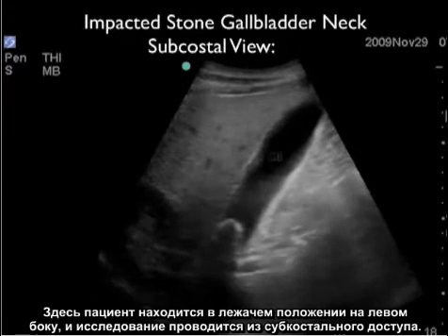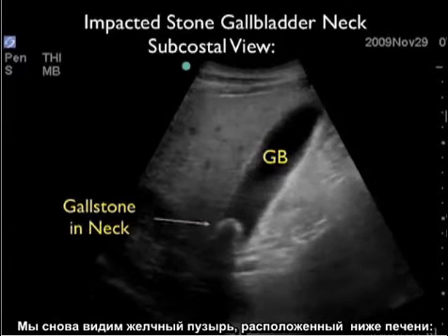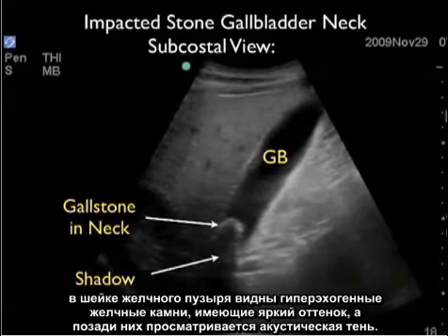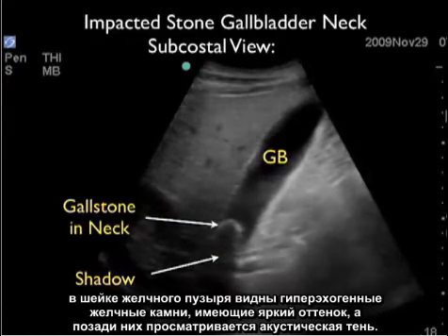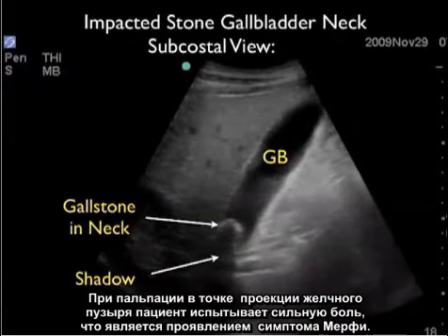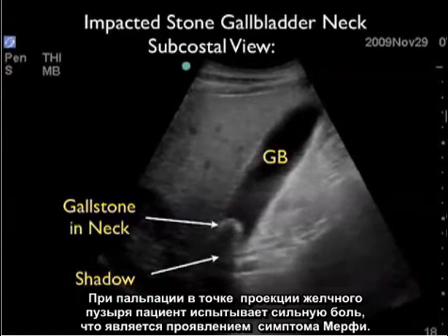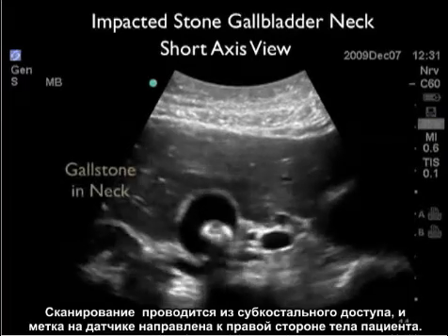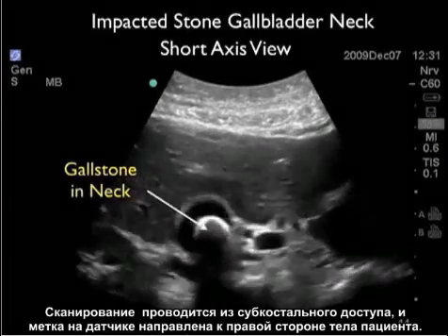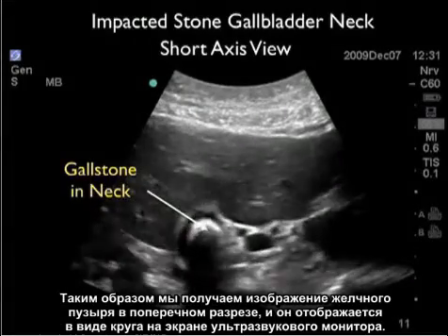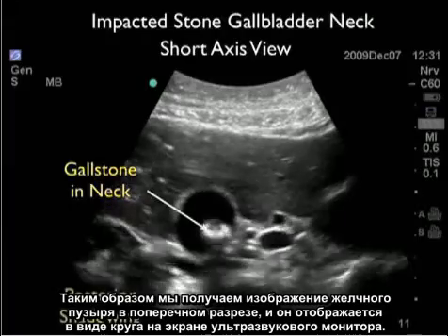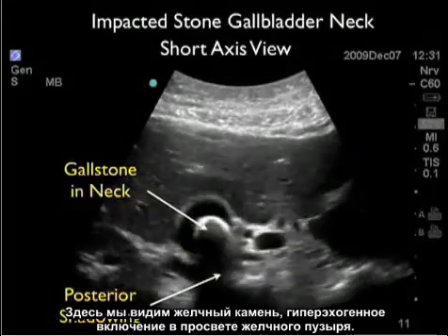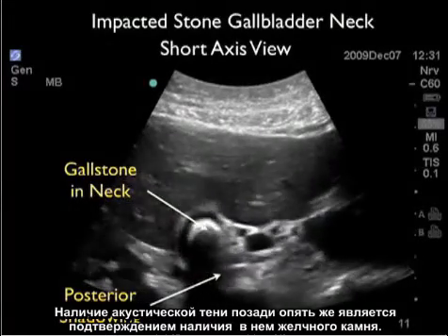Here we've moved the patient into the left lateral decubitus position and we're looking from the subcostal plane. Again we see the gallbladder stretched out inferior to the liver, and within the neck we see the hyperechoic bright gallstone with posterior acoustic shadow. As we press down on this gallbladder, the patient had a lot of pain confirming a sonographic Murphy's sign. Changing the probe orientation into short axis configuration, we're cutting the gallbladder into cross-section so it appears as a circle. We see the hyperechoic gallstone within the lumen and again the posterior acoustic shadowing confirming its presence.